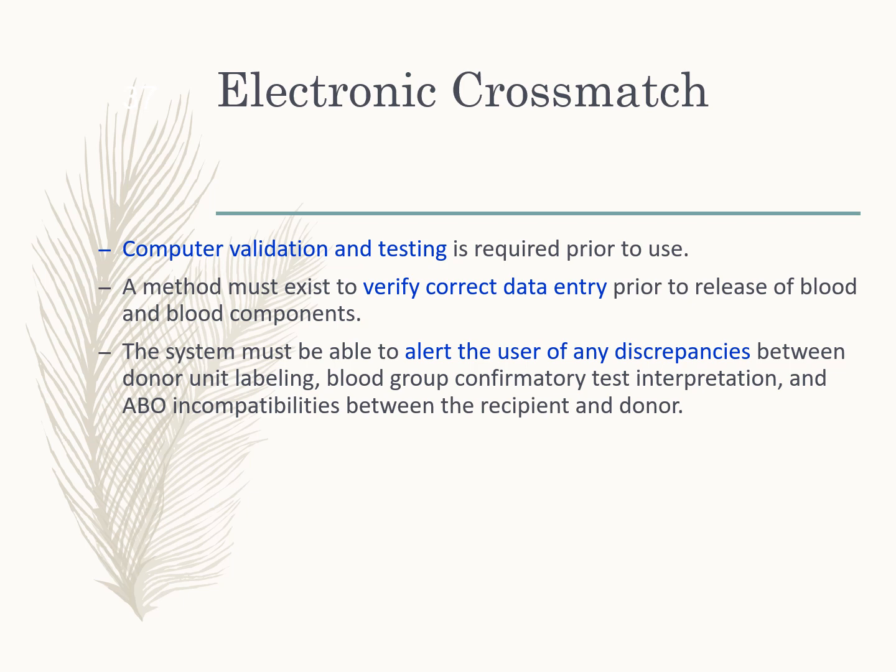So in order to perform an electronic crossmatch, computer validation and testing is required. A method must exist to verify correct data entry prior to release of blood and blood products. The system must also be able to alert the user of any discrepancies between the donor unit and the blood group confirmatory test.